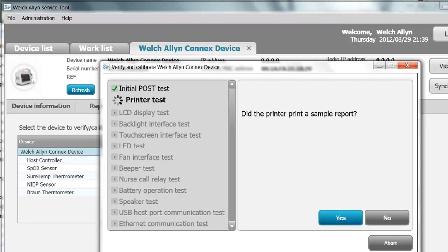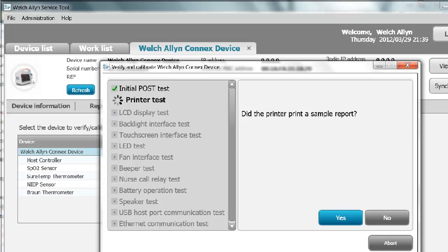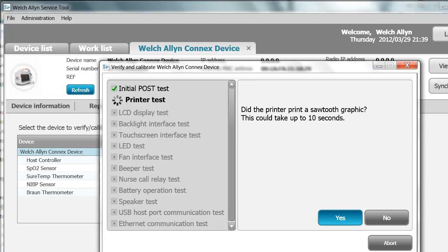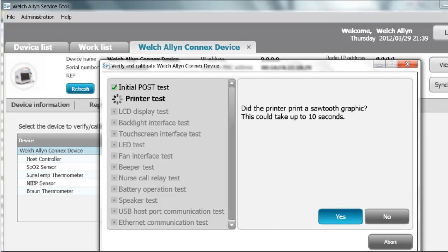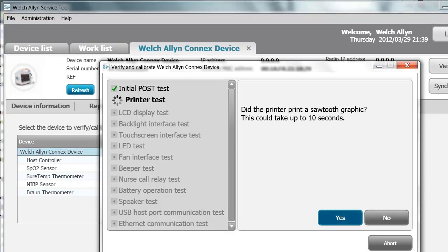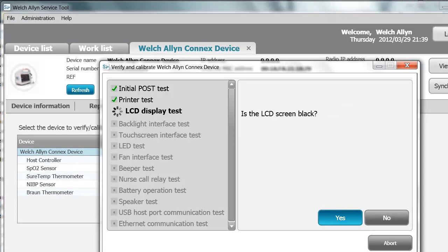As it proceeds through the test, you will see a spinning icon, which means the test is in progress. A green check means the test has been performed and passed. A gray box with a dot means the test is to be performed. A red X means the test failed. Just answer the questions. Did the printer print a sample report? It did, so click Yes and Continue. Did it print another one? Yes.